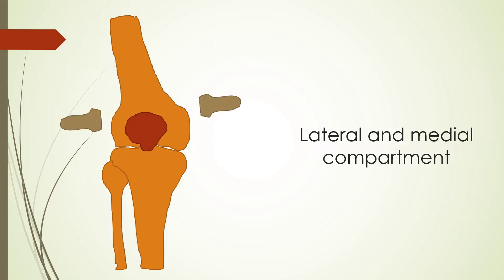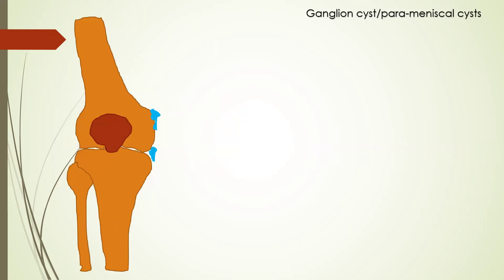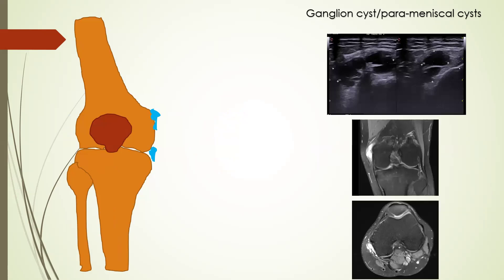Next we evaluate the medial and lateral compartments. We can see ganglion cysts and parameniscal cysts in the lateral and medial compartments. Ganglion cysts can occur anywhere with or without communication with the joint capsule. When these cysts are seen in relation to the menisci associated with a horizontal meniscal tear, they are called parameniscal cysts. In this case there is a complex cyst in relation to the medial femoral condyle, away from the meniscus — this is a ganglion cyst.